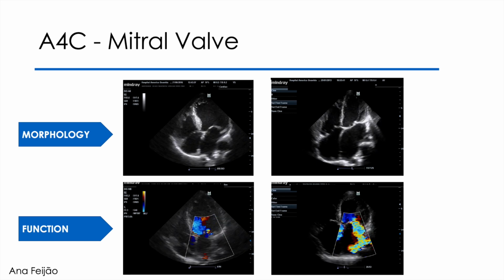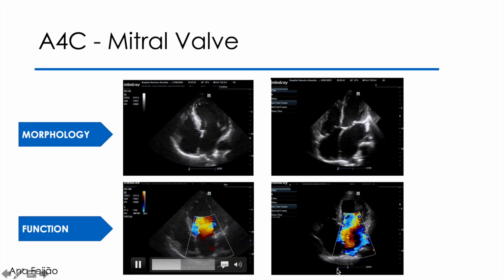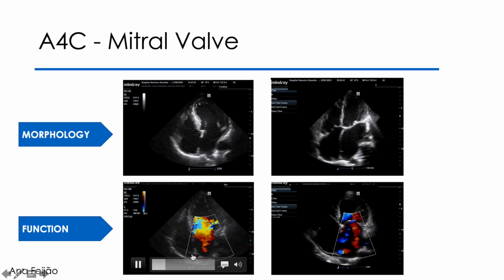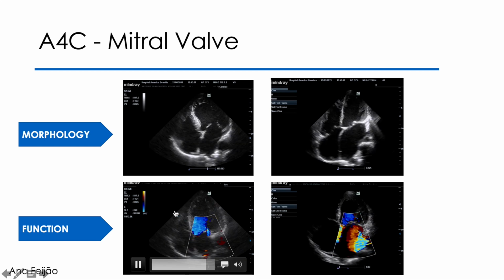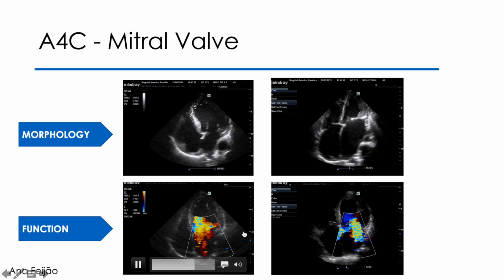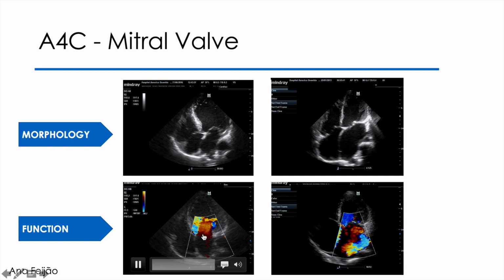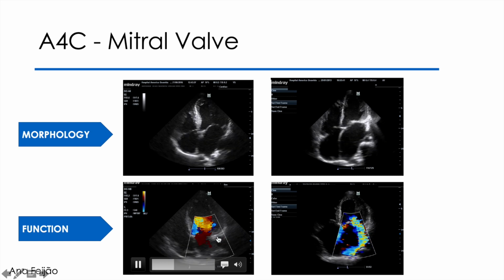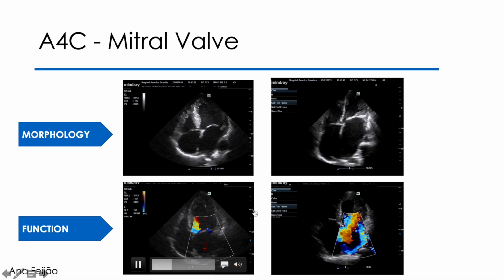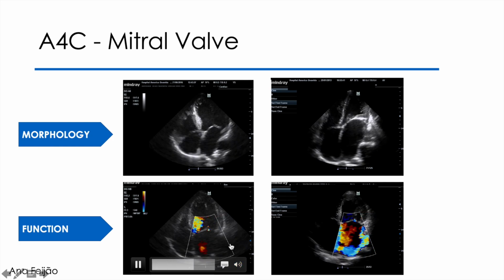After evaluating the mitral valve by two-dimensional, I evaluate it with color Doppler. I call the color Doppler window, lower the general 2D gains, and orient the size of the sector so that the mitral valve is in the middle and be able to perceive the dynamics of the diastolic flow and regurgitation.